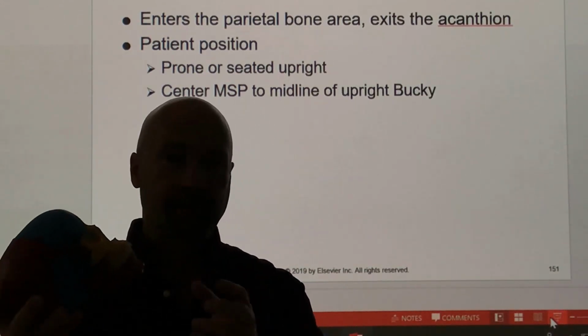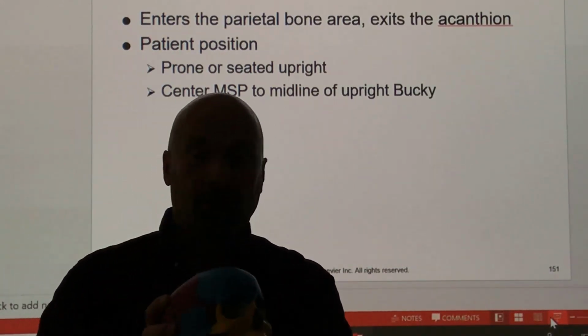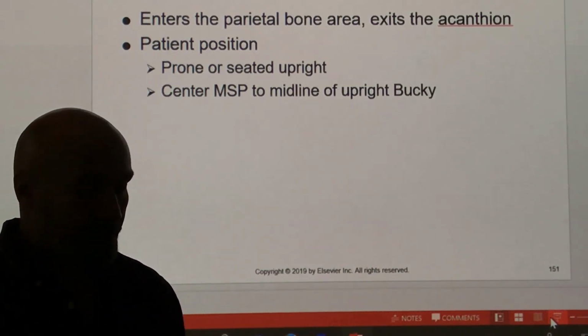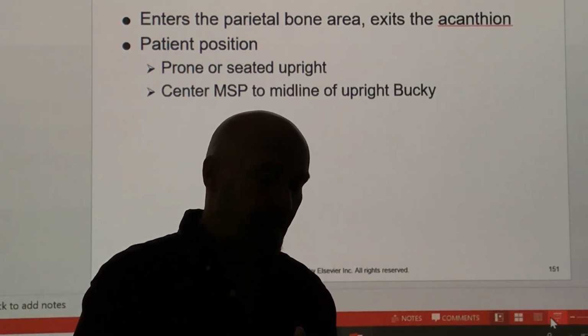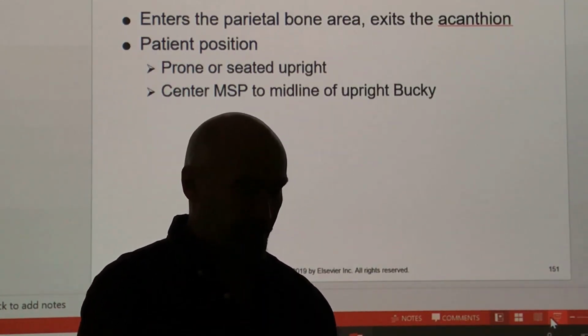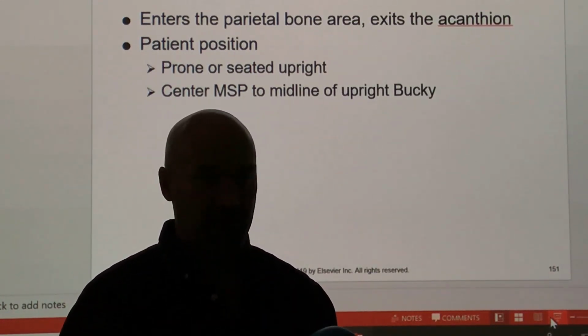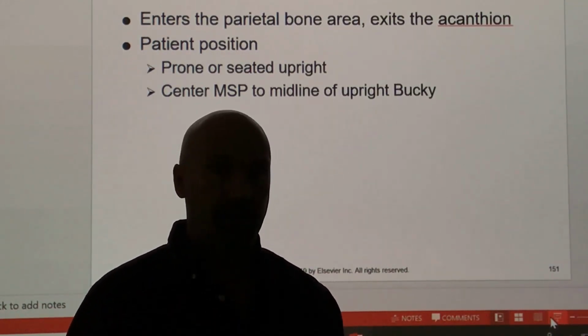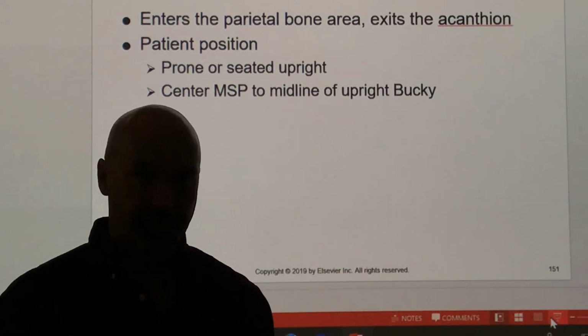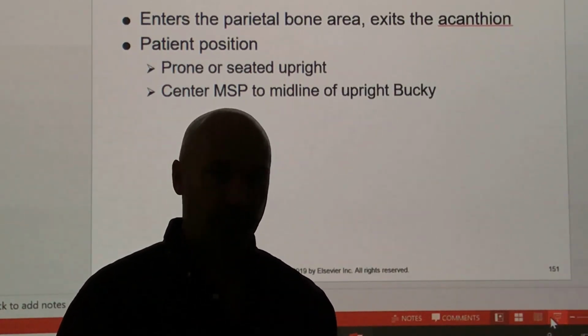so that we can see evidence of a blowout fracture. You're probably not going to see the blowout fracture itself for a couple of different reasons. First is the thin bone. And the second thing is, because it's thin bone, and it's pushed down into the maxillary sinus that is full of fluid, the thin bone just won't show up. You can't make out the difference between the thin bone and the fluid itself.